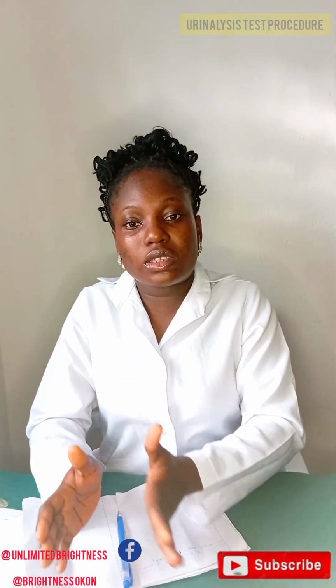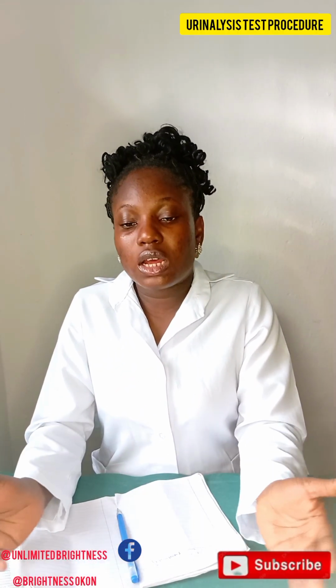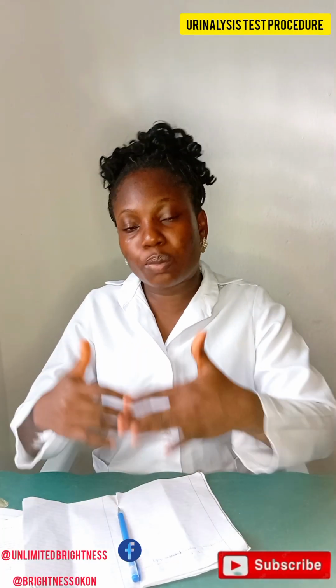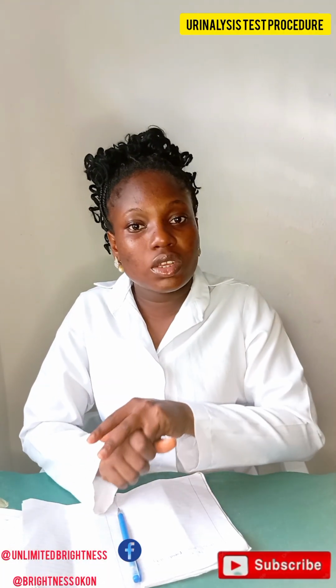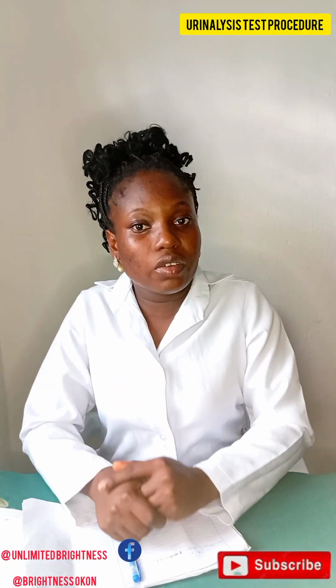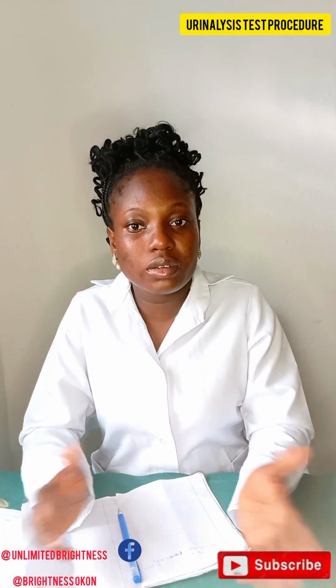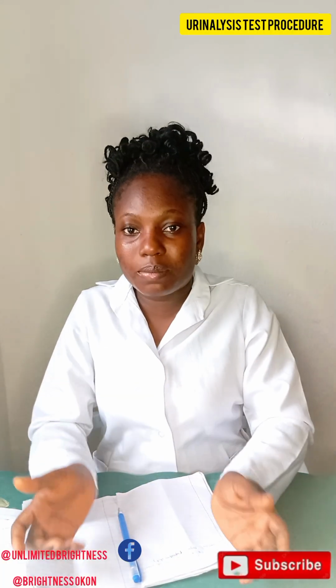Then we go as far as looking at the chemical aspect of it. We have the normal and abnormal constituents in urine, the things that are supposed to be in the urine and the ones that are not supposed to be there. The normal constituents are such as the pH and the specific gravity. The pH is the hydrogen ion level in the urine. If it is too acidic or too alkaline, it calls for alarm.